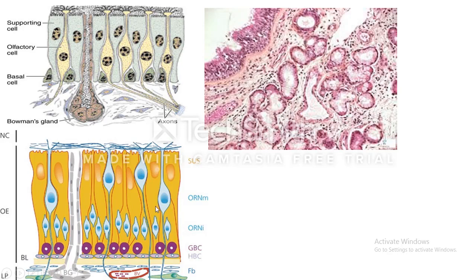This is a schematic. Bipolar cell. This is a bipolar cell. Bipolar cell supported by supporting cells and basal cells. Very good.